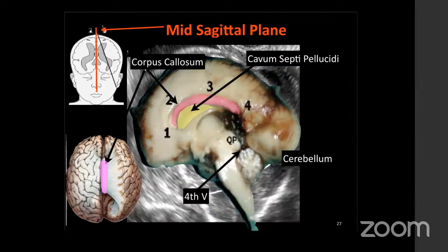Now, before going into the structures, I would just like to look into the mid structures which form the mid-sagittal plane. One such structure which draws everybody's attention is the corpus callosum, right? What is corpus callosum? It consists of around 200 million white matter fibers, which are densely myelinated, which cross across the hemispheres, transferring vital information: motor, sensory, and cognitive. So that is one structure you see.